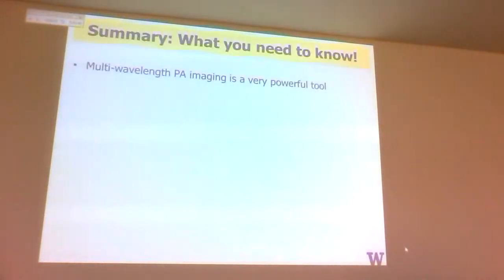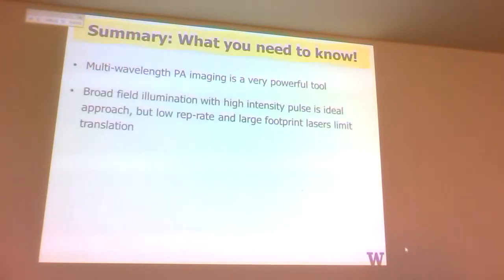Okay. So, what do you need to know from this stuff? Multi-wavelength photoacoustic imaging is very powerful. It allows you to take advantage of the richness of the optical spectra that you have for biomolecules, but in a way in which you can do at depth.